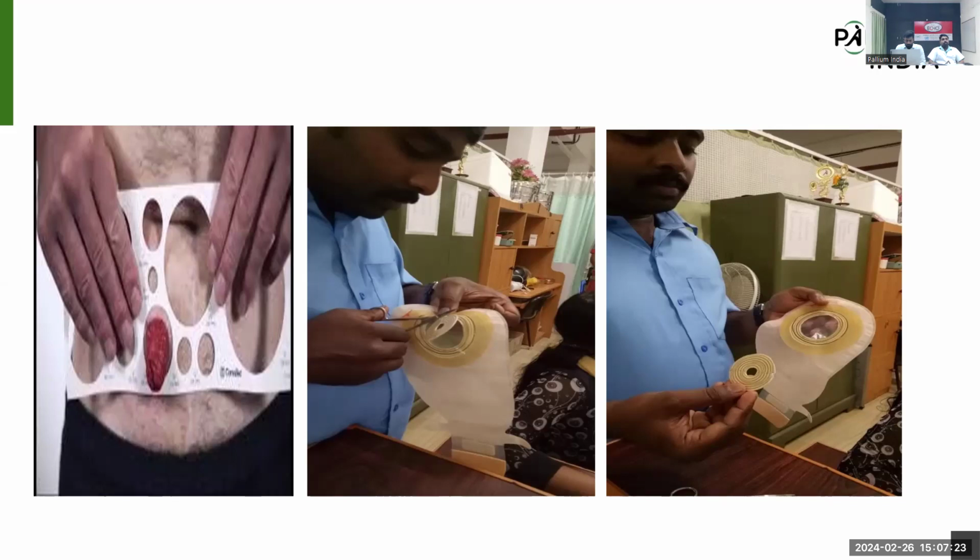Some circles are there. For one patient the stomal size will be different. So it will vary. According to the patient's stomal size, we need to select the bag. Here this gauge we can use for getting the proper size. We need to place this measuring gauge circle around the stomal region. When choosing the size, it should not be too tight or too loose. So we need to select the proper, accurate size.